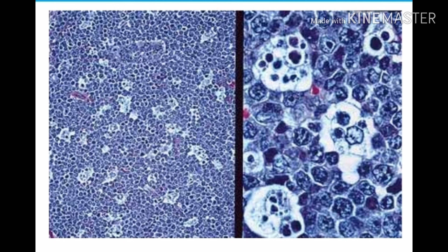This is the case of Burkitt lymphoma with starry sky appearance, which comprises lymphocytes and macrophages. The night sky is represented by the dark blue lymphocytes, while the stars are represented by the macrophages — tingible body macrophages. So this is the starry sky appearance of Burkitt lymphoma.